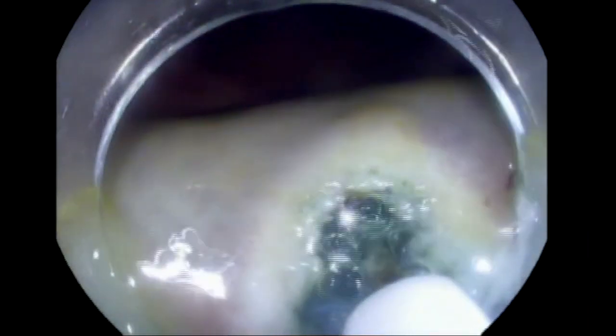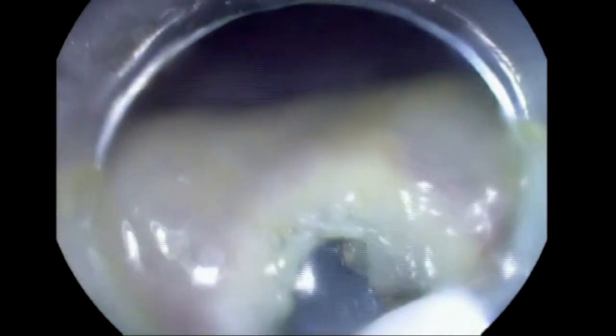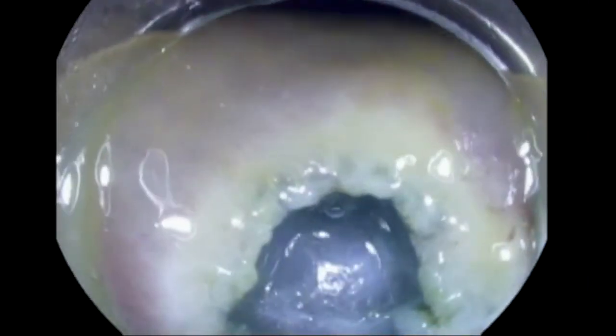Unlike POEM, our position is a little bit harder because we're in the stomach and the scope is curved. So you really have to work hard in making this entry point easier to approach.